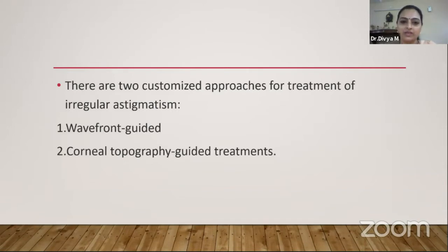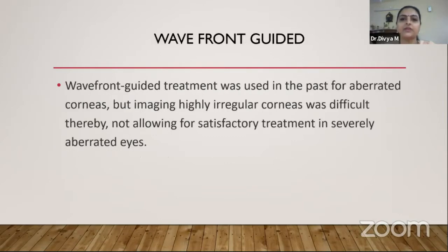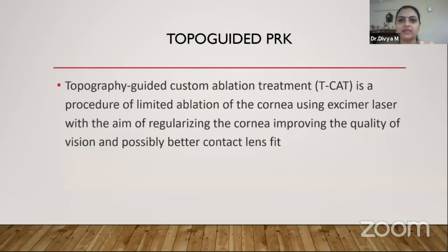So we know there are two customized approaches for treating irregular astigmatism. One is the wavefront guided, and the other one is the corneal topography guided treatments. The wavefront guided treatment was used in the past, but now we don't recommend that much because of the problem of repeatability in these eyes.